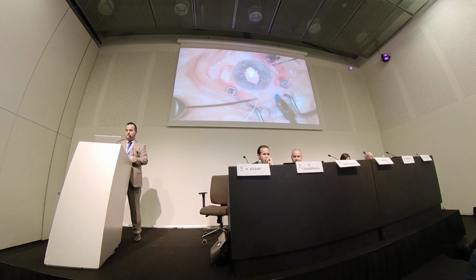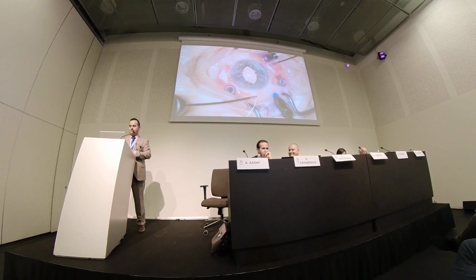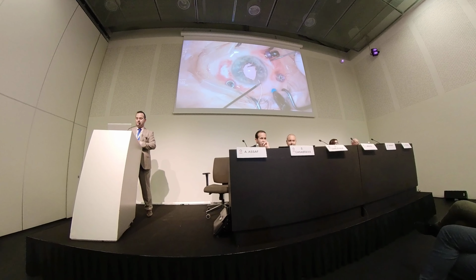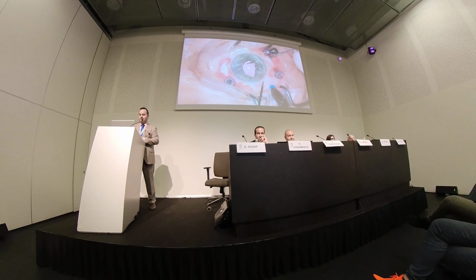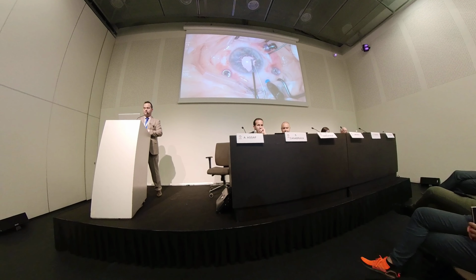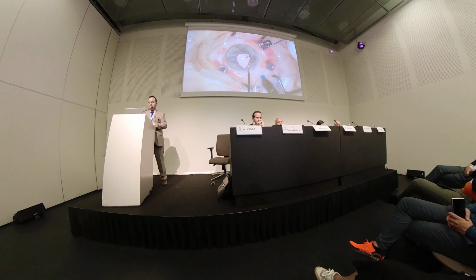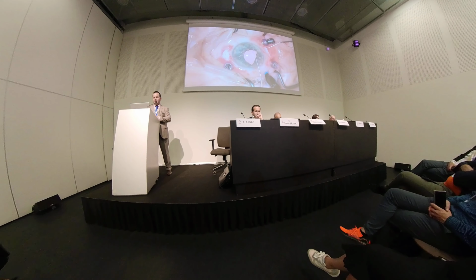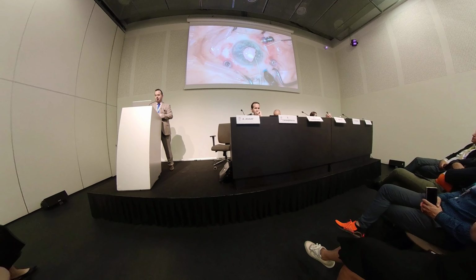Yeah, sometimes it's difficult to find the sclerotomy. And here even it's easier to find the eyelet. Sometimes it's not so easy to handshake the other instruments. So the same trick here.